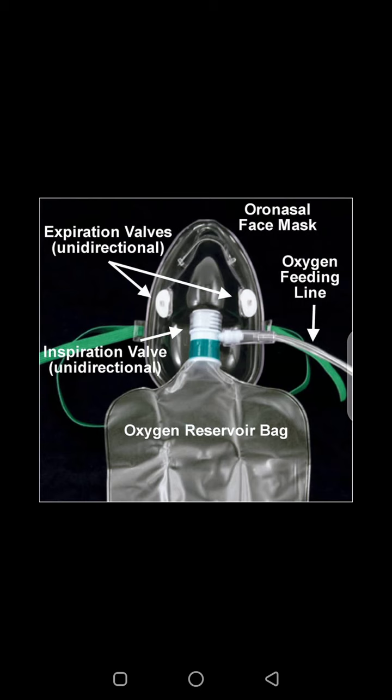So it is called expiratory valve because it only opens when the patient exhales or expires. And that is the only direction airflow goes, from inside to outside.